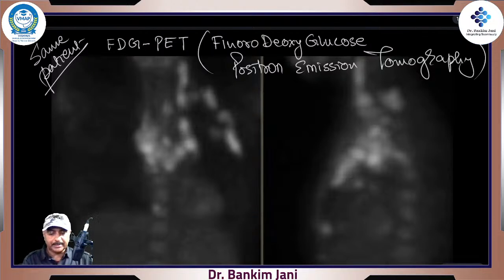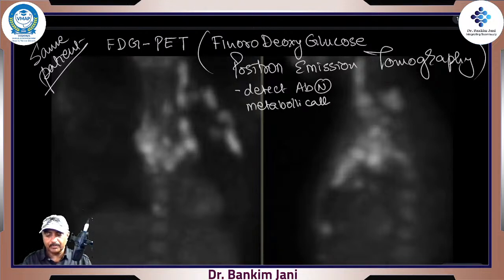So what it really does is, it does two things. One, it will detect abnormally metabolically active lymph nodes.